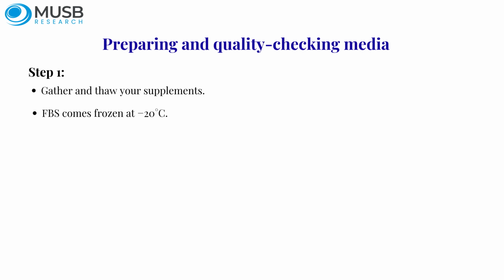Okay, I'm going to walk you through media preparation exactly as it happens in real practice. Every step matters. Let's go through it. Step 1. Gather and thaw your supplements. FBS comes frozen at -20 degrees Celsius.